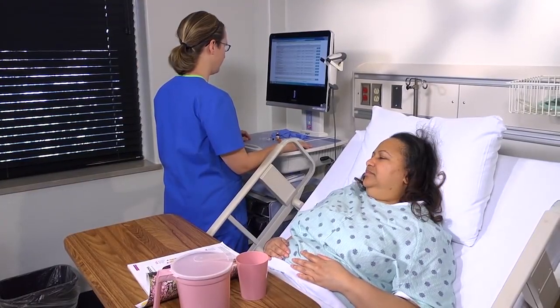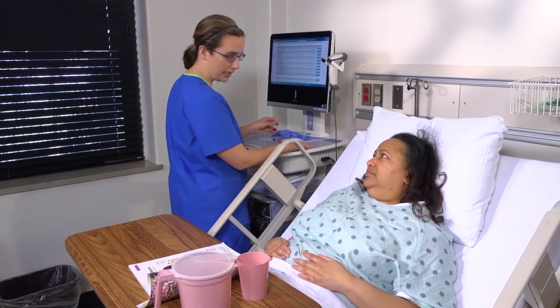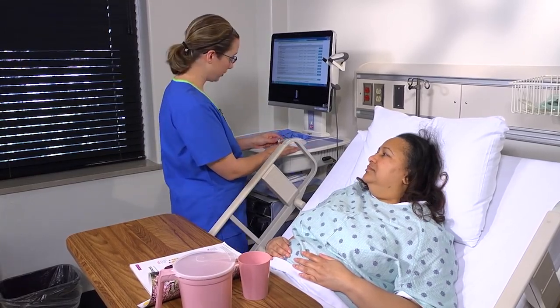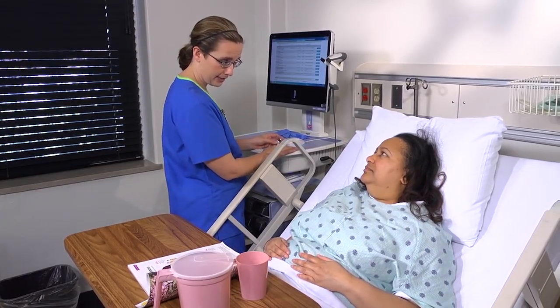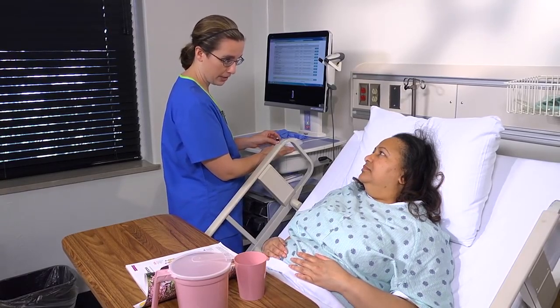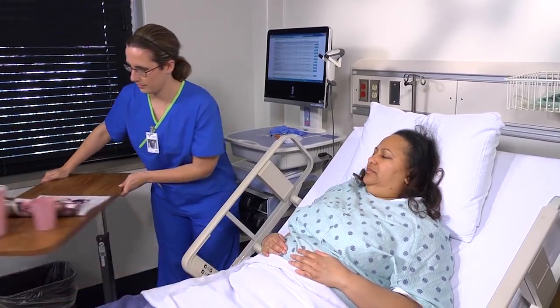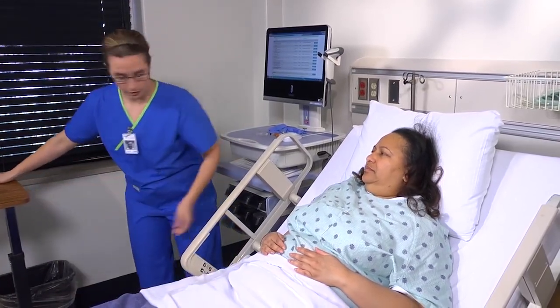At the bedside, once again compare the medication label with the MAR. This is your third check. Tell the patient why she's getting the medication, what it does, and what its potential side effects are. Encourage her to ask questions. Caution her that the injection may cause a slight stinging or burning sensation.